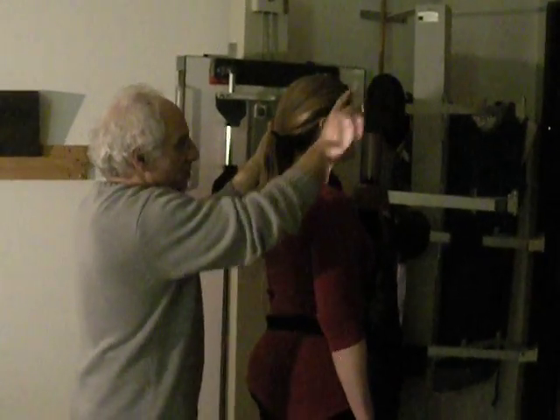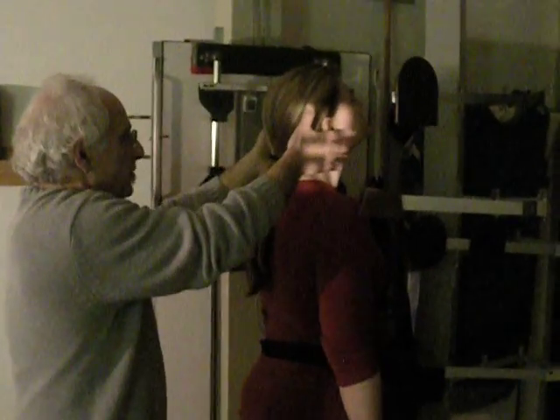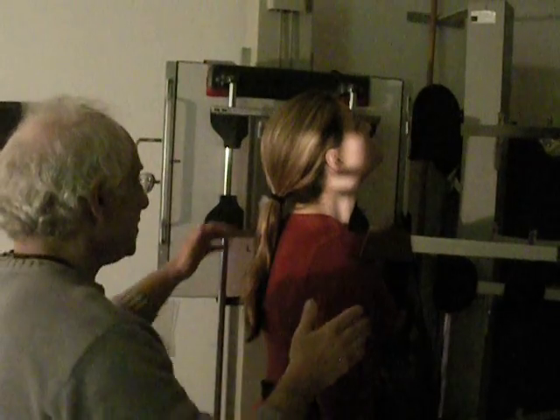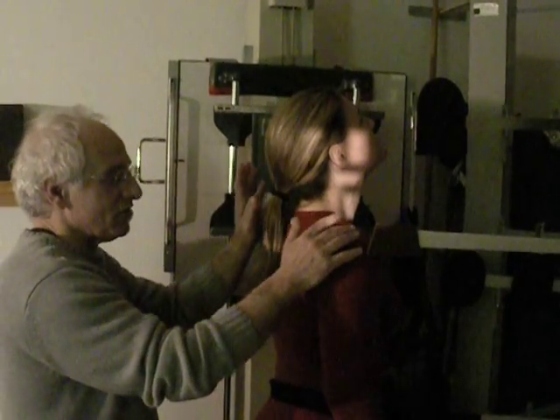And beep. There. So if we wanted to go into flexion extension now, we could have the patient stick your chin out as far. Of course, we changed the film while we were doing this. We stick your chin out and bring your head back. That's nice. Don't pull, don't push, okay? And same thing. Check the body from the front, because sometimes patients just antalgically kind of list one way or the other. You want to make sure that they're straight. This is a nice extension.